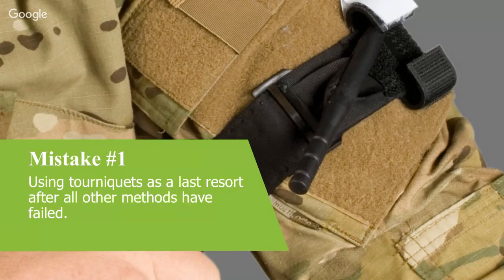And Jason, looking at your comment there, that's very similar to what we're seeing in Australia: second line use. So not quite last resort, but if you've failed already with other applications of direct pressure or compression dressings, then move on to your tourniquet use. That's a different stance, as Jez mentioned, to the TCCC guidelines, where it's a first intervention. The important thing to realise here is it's contextual. If you're in a high threat environment where you don't have the time or the light, or it's not tactically appropriate to accurately assess the wound and say yes, that does need a tourniquet, then you want to apply it straight away. And hence in TCCC, we apply them straight away.